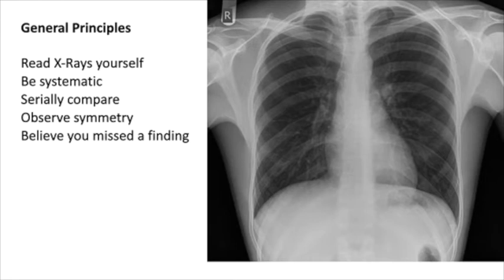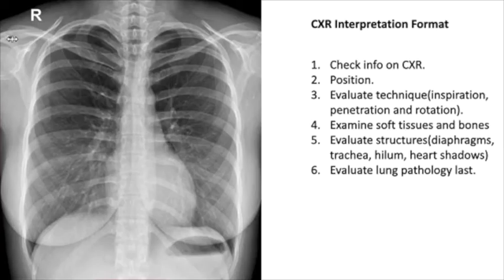Reading the X-ray is the most difficult thing for any radiologist or doctor. Chest X-ray is very difficult for any radiologist or doctor in general. It's very difficult, so you have to take this seriously. Apart from the general principles which you have to apply to any type of X-ray, you have to also take into consideration today's advice about how to read a chest X-ray. So remember, apply that principle and then the specific steps on how to read a chest X-ray.